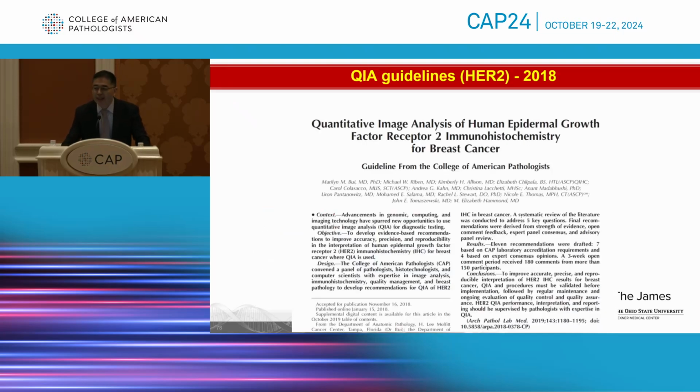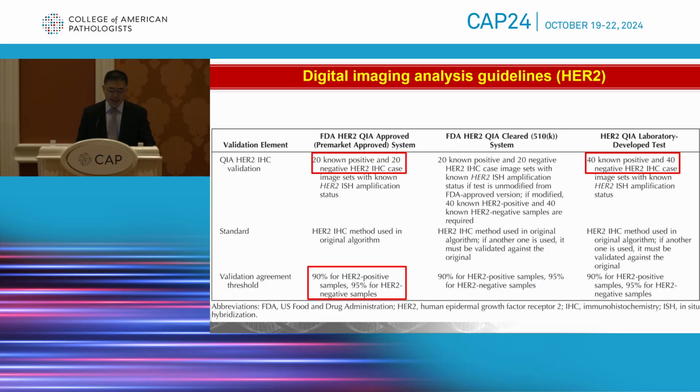There are guidelines available for digital imaging analysis for quantification, but these guidelines are only for HER2. This was published a while ago, I think in 2018.